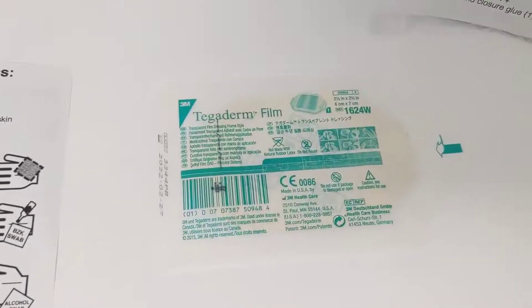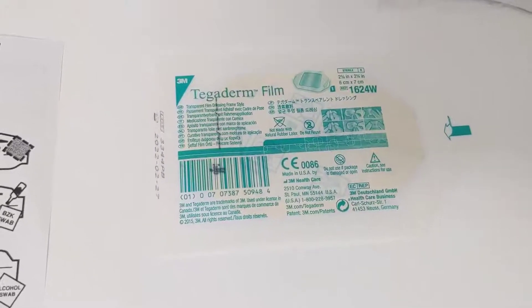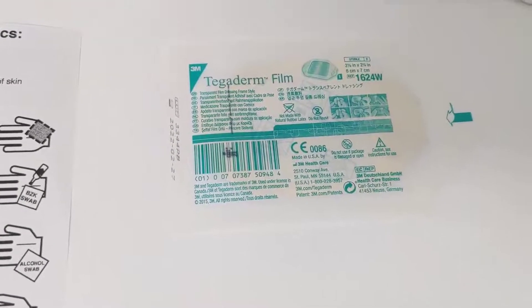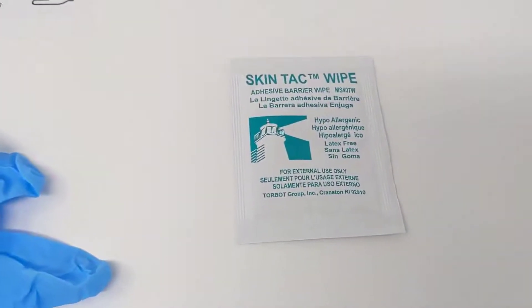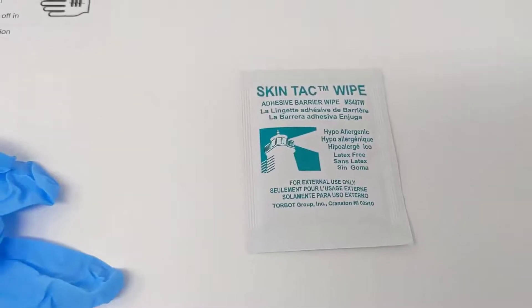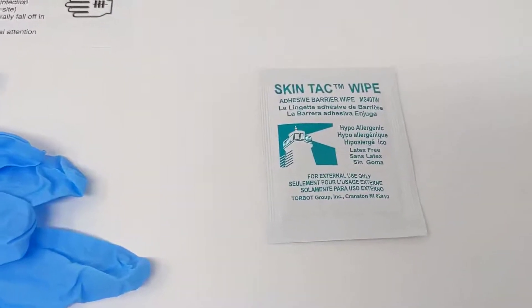You have a Tegaderm film dressing that you can apply over top of the Steri strips or glue once you've applied it, to create a second layer of skin that's breathable to prevent infection from coming in. You have a skin tack wipe and this is really going to help to wipe around the laceration before you apply the Steri strips or the glue, and it'll improve the adhesion of those Steri strips.